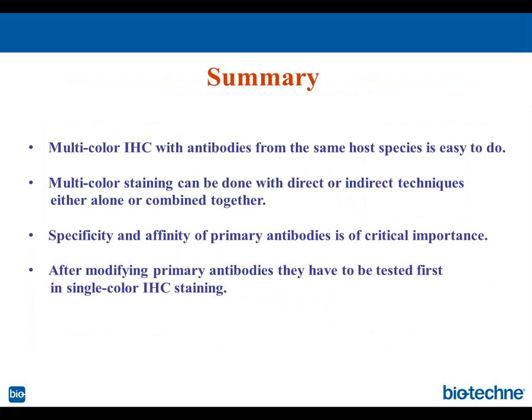When it comes down to CNS, it's not a big problem. We can use mouse brain and mouse primary antibodies because, as we all know from histology classes, the brain is behind the blood-brain barrier, so there are no IgGs floating around. So there's no cross-reactivity of secondary antibodies with IgGs in the brain, unless there is some damage to the brain. But let's say we're trying to stain lymphatic tissue, spleen, lymph node, tonsil. Then it's a big problem, because with our secondary antibodies, no matter how good our blocking of mouse IgGs in this tissue is, it's impossible to block all of it.